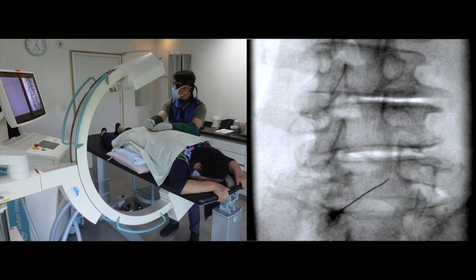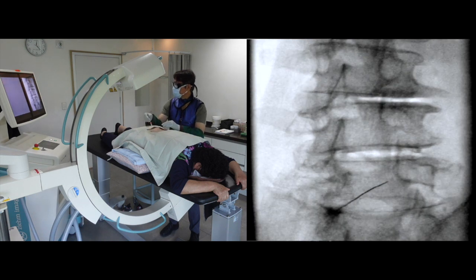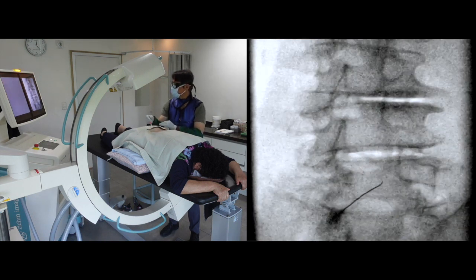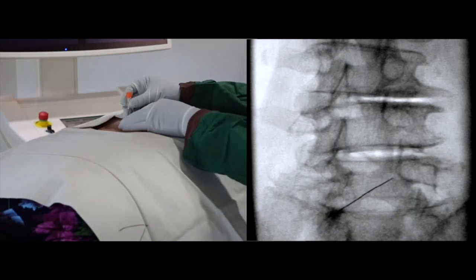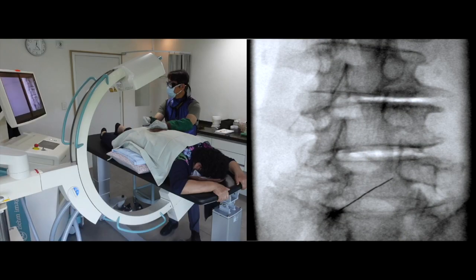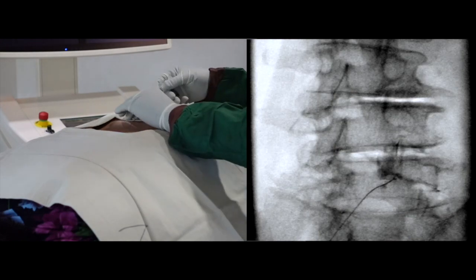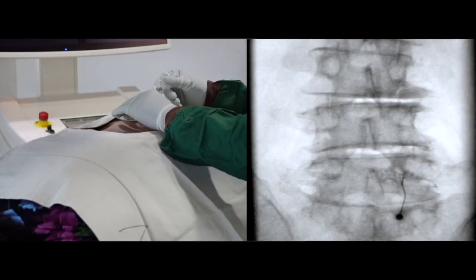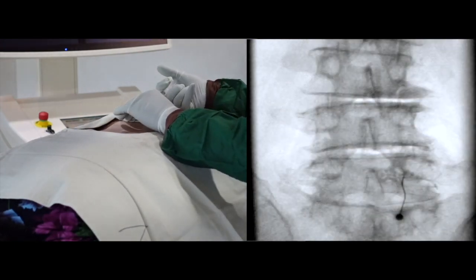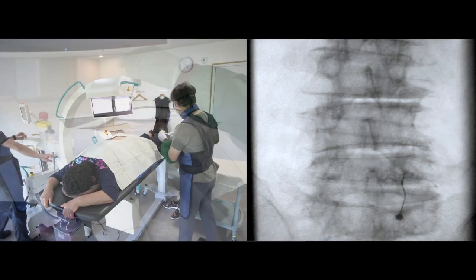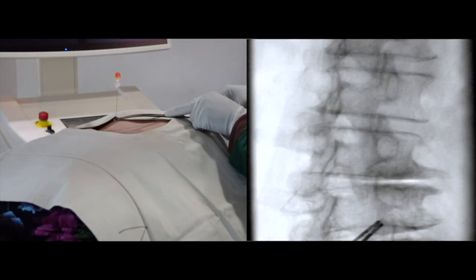Let me turn to the ipsilateral oblique C-arm view. Contrast media injection. It is AP view with arthrogram. I will administer a steroid mixture containing botulinum toxin. The next target is the right L3-4 facet joint.